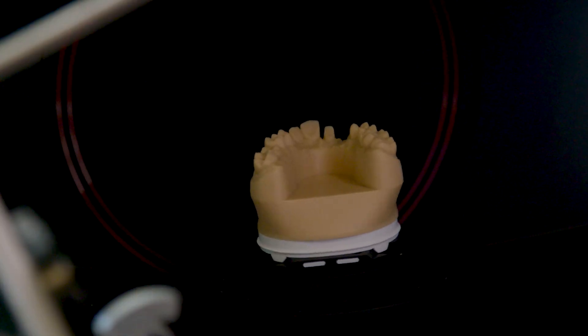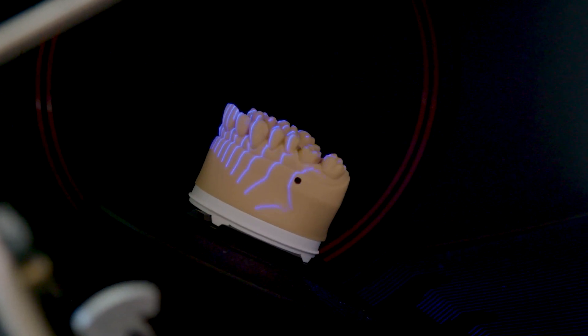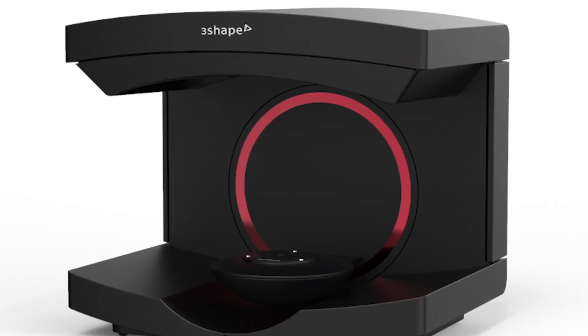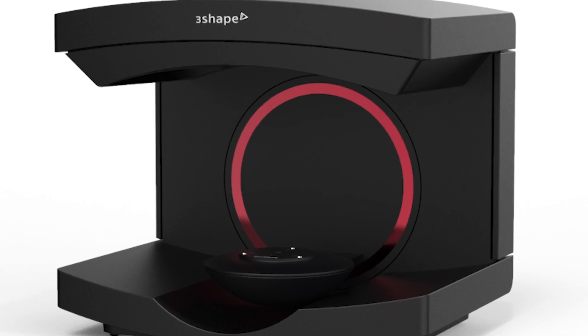Visually, the red e-scanners are similar to the existing e-scanners. The only difference being the red foils instead of the silver. At 3Shape, we are very passionate about the work we do, so I can tell you that there were a lot of discussions about the shade of red to be used on the foils.